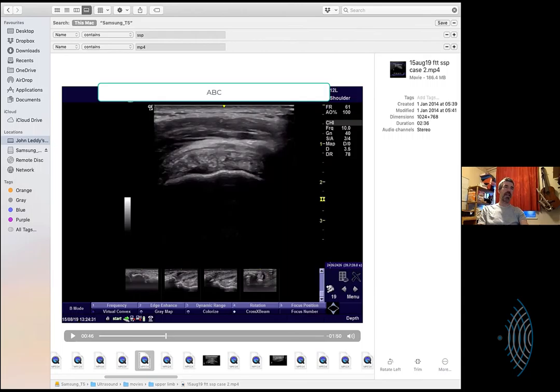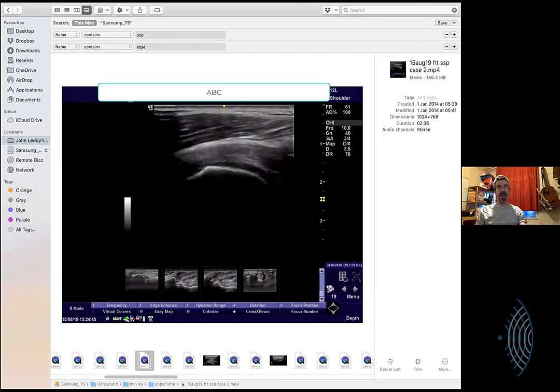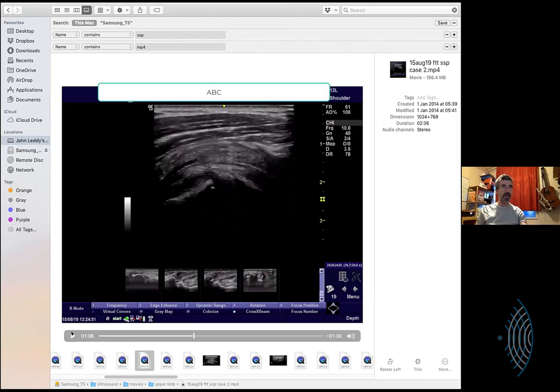Wow, that's beautiful. With this sort of low hill shape, you know, bundle, bundle, bundle, much like the subscapularis, like you were pointing out. Much like subscapularis, very similar in architecture. But you have actually then turned the plane of your scan a little bit more posterior.